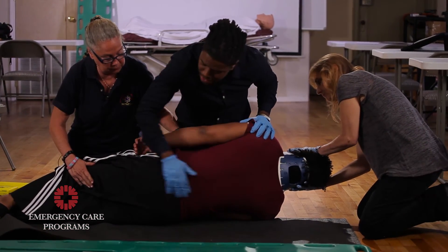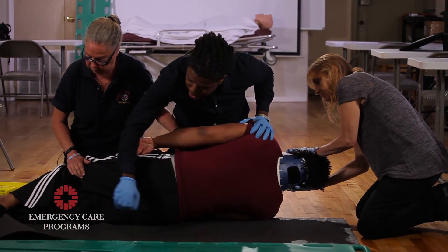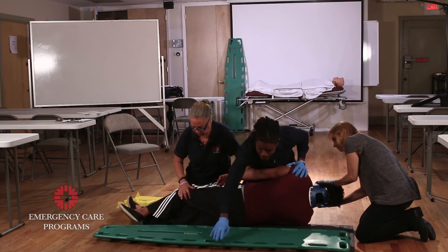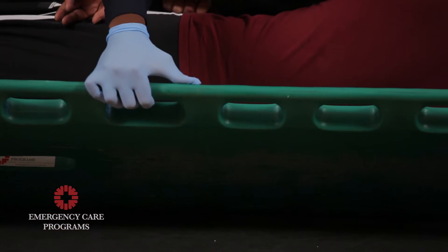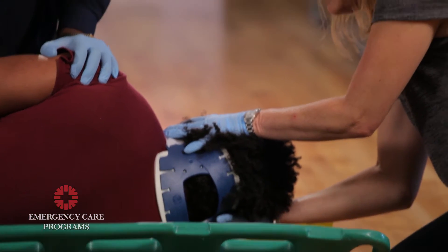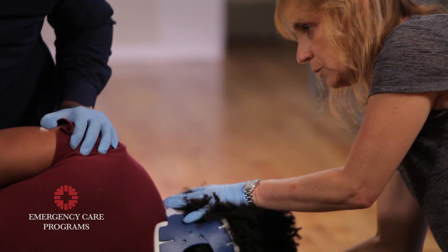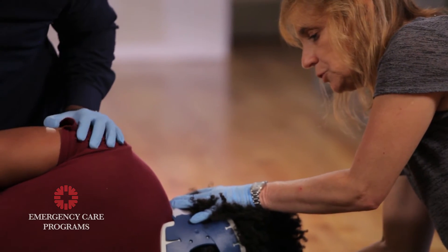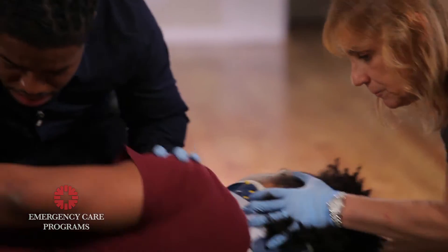Quick scan of his back to make sure there are no injuries. I'm going to hold the board at a 45-degree angle. On the head person's count, we're going to log roll him back over. One, two, three.